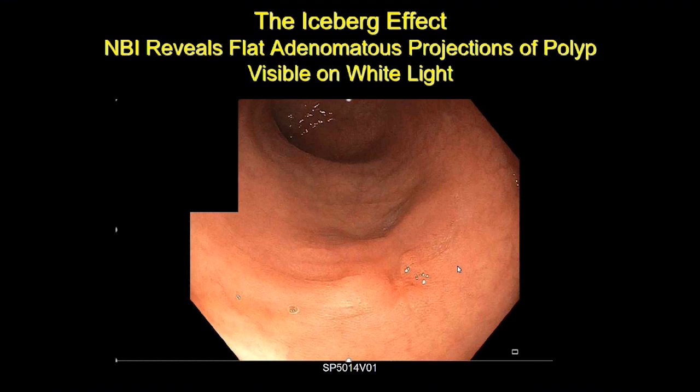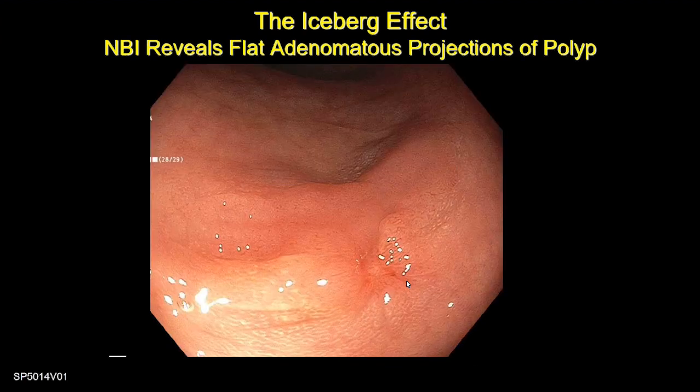And we see in white light the area, there's a little scar here, and we see this little area there. We say, aha, there's a little bit of residual polyp. Great. Okay, that's what we see. Look carefully at the subsequent pictures. So this is a closer up near focus view, and you see a little bit better some of these patterns of vessels that look adenomatous in this area, and these look like they're normal areas around here.